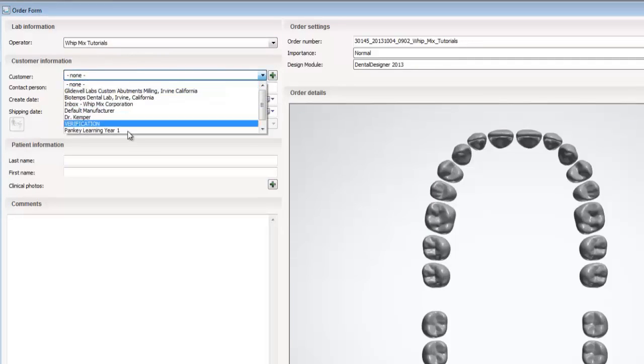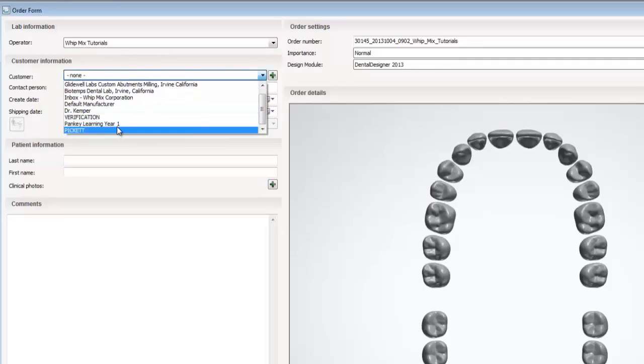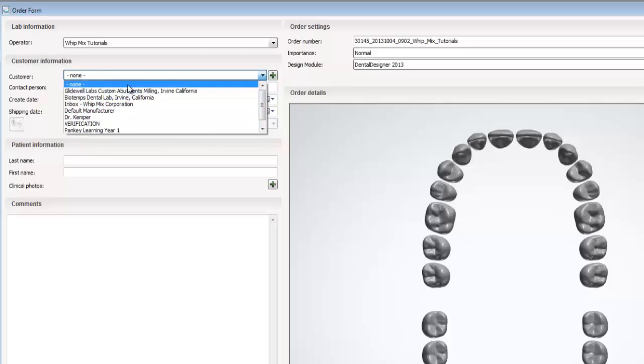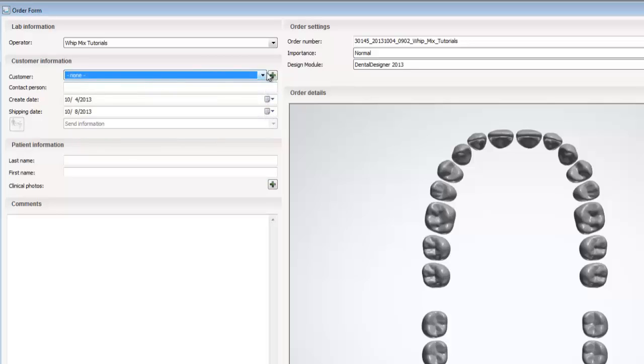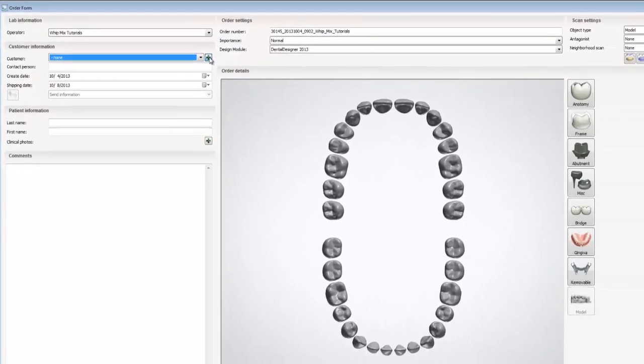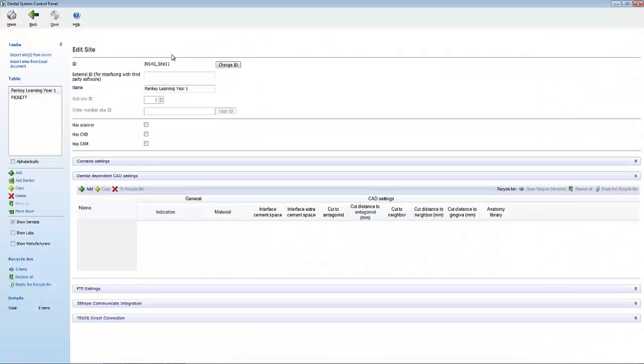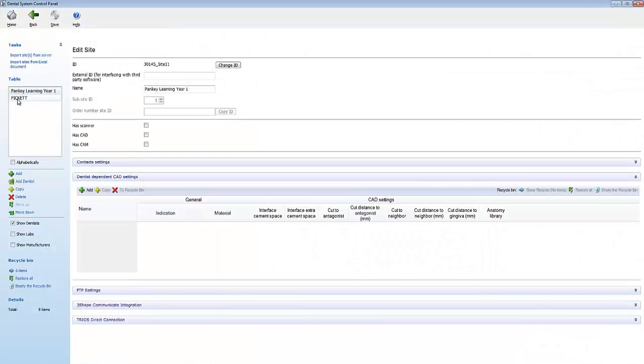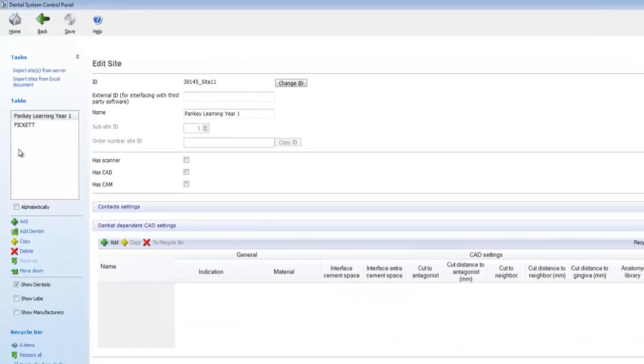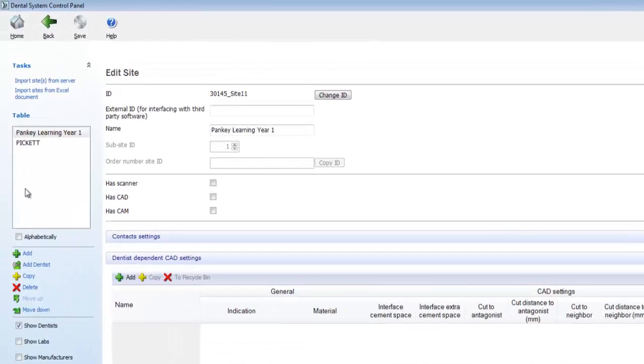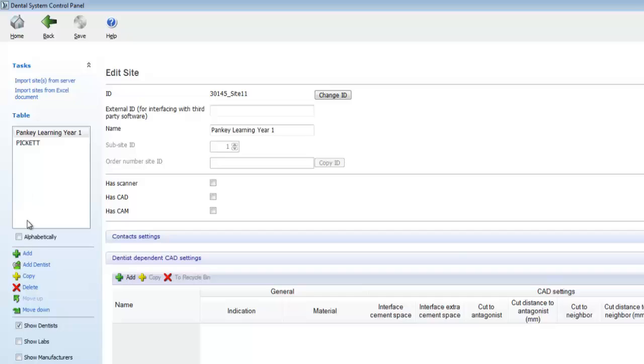Now we want to add our lab to the customers list, because it's not in the list currently. To do this, we simply click on the plus sign next to the customer drop down menu. This will open up the control panel. Once the control panel opens, we'll see a list of other labs in the system. We can sort the list alphabetically by clicking in the check box in front of alphabetically.